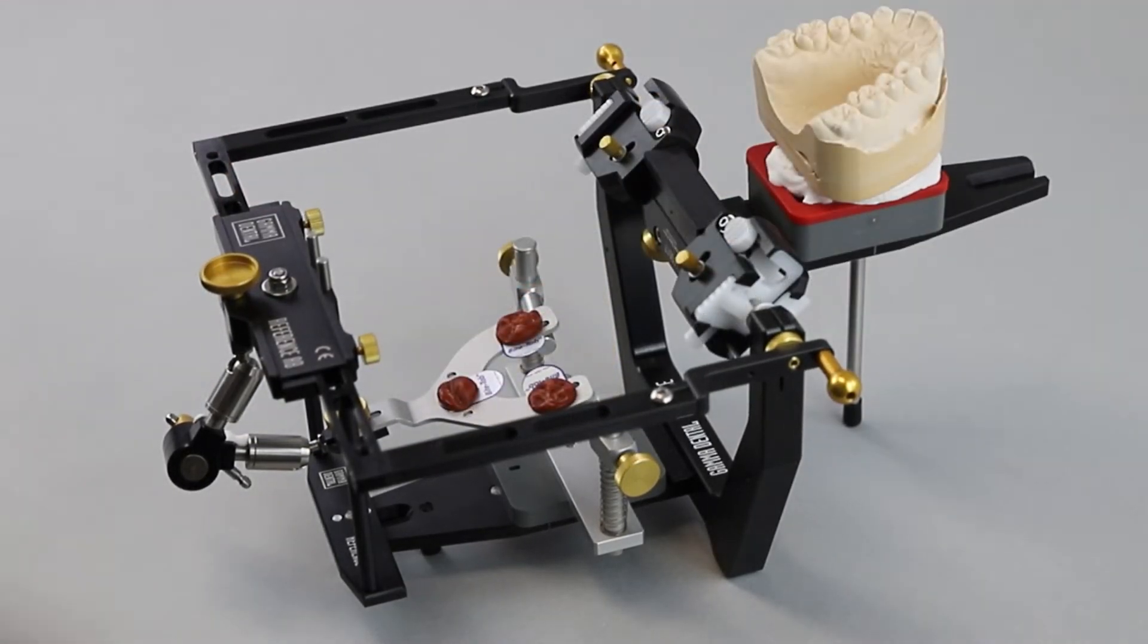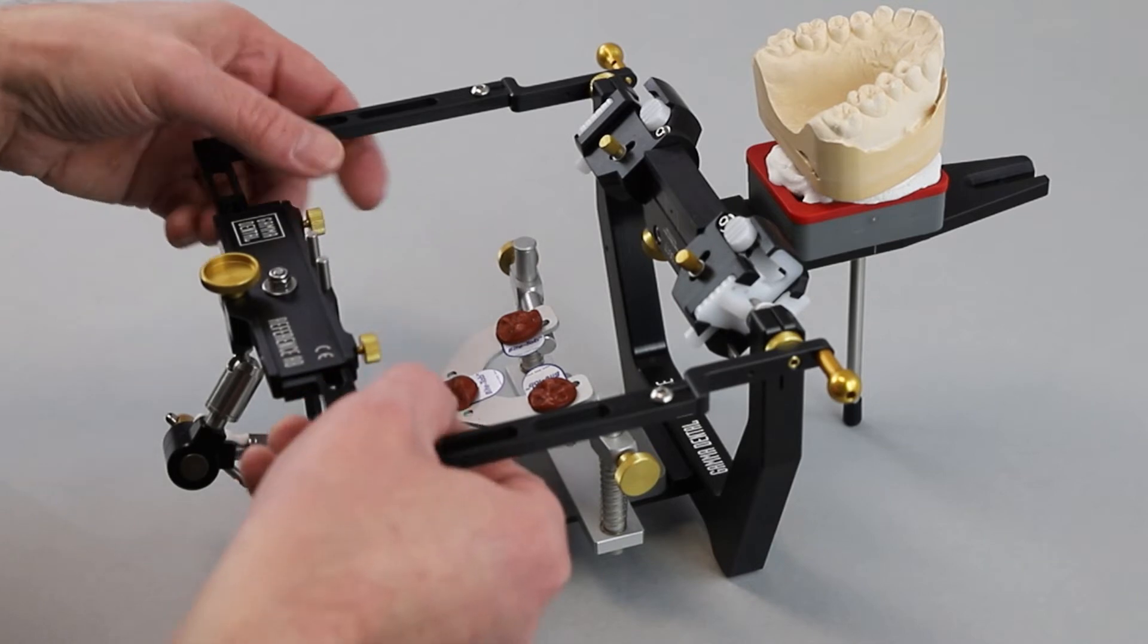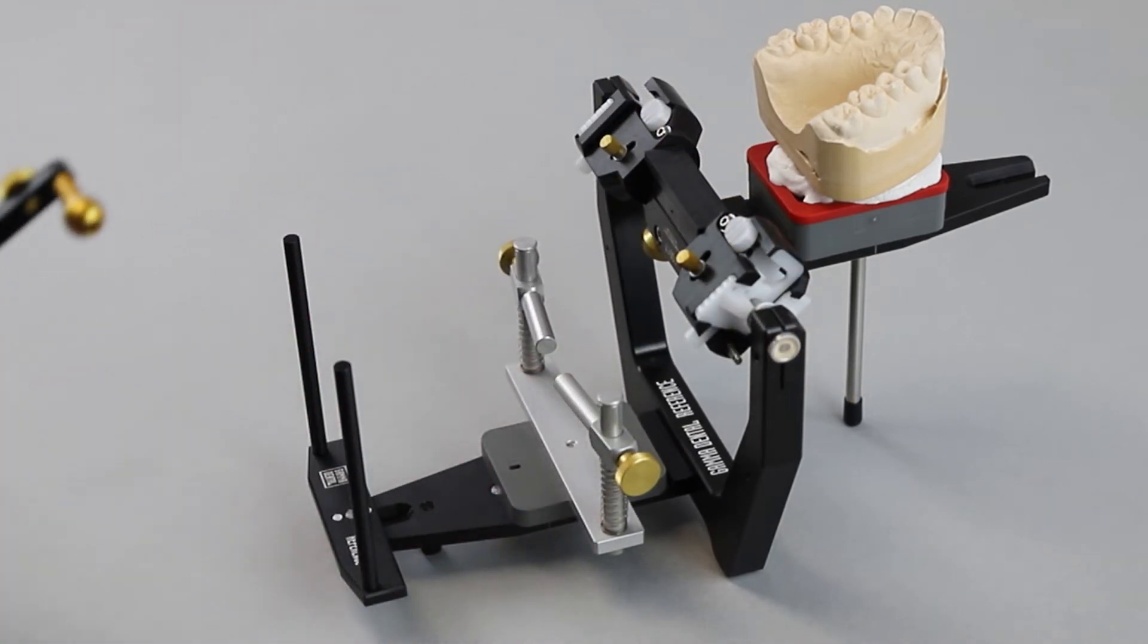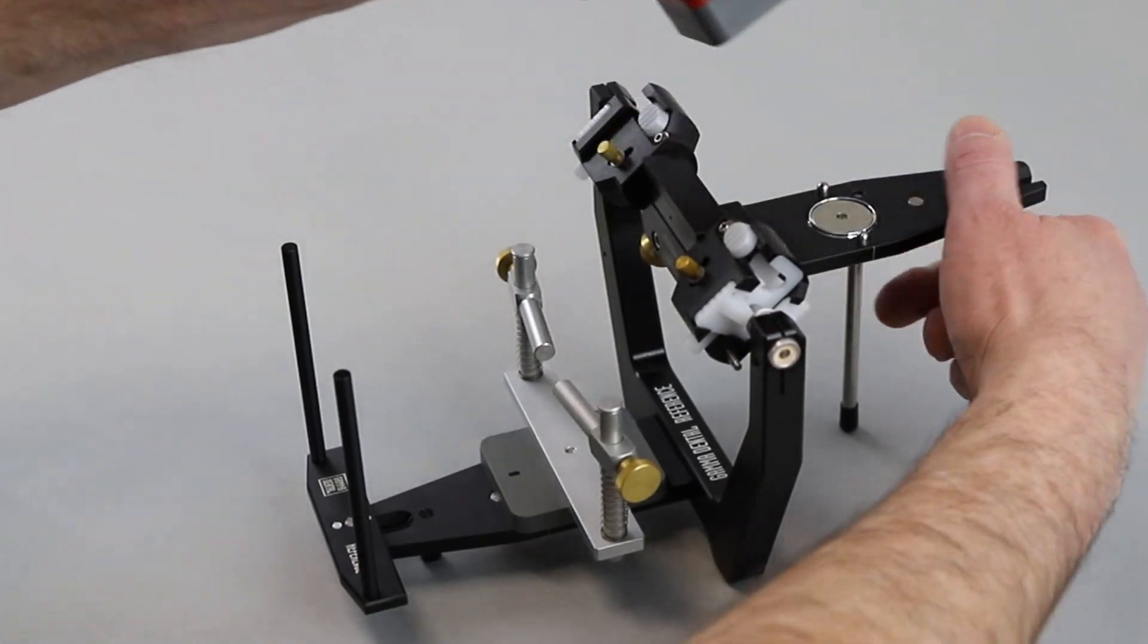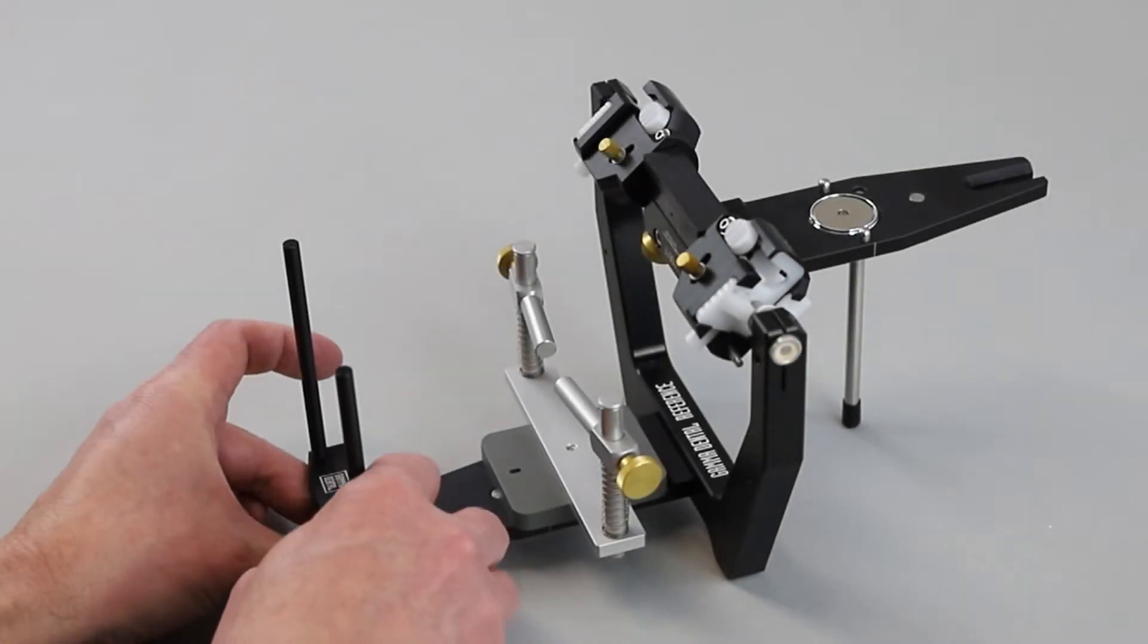Afterwards, the reference AB face bow can be removed from the articulator. The mount of the lower cast relative to the anatomic axis is carried out in the articulator.